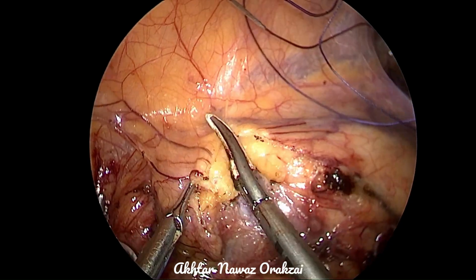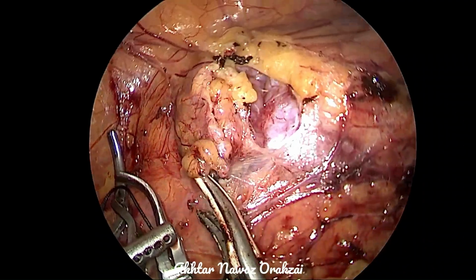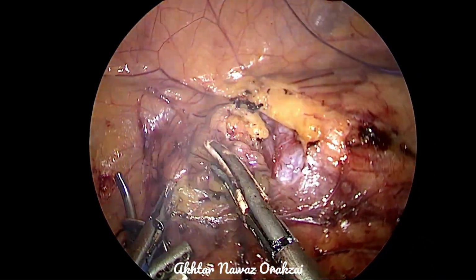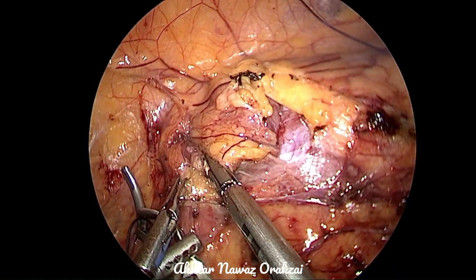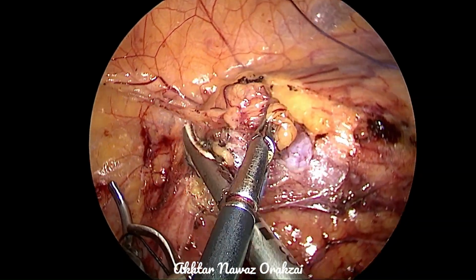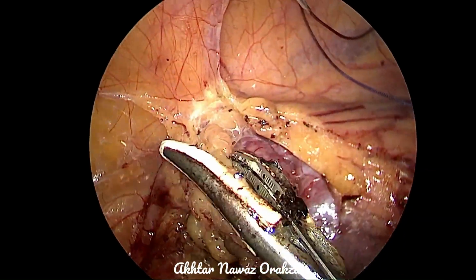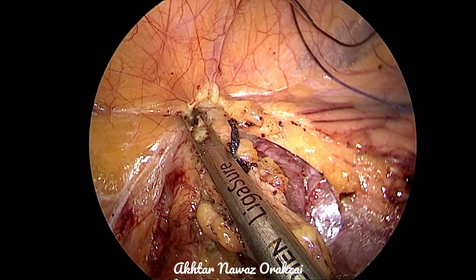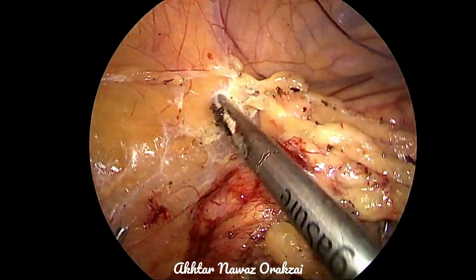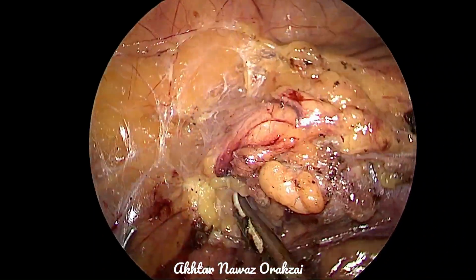So we are cleaning around the tumor to know where the base is. I'm not removing the fat and the Gerota's fascia which is overlying the tumor or covering it. There are two reasons for that. Number one, we need to keep it on the tumor so that we know by microscopy whether there is any involvement of this fat or not, to know the invasion. This is reason number one.